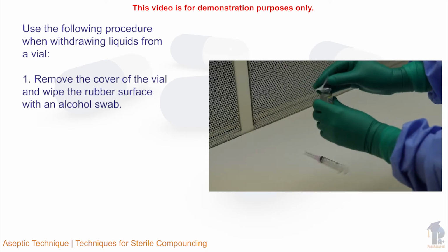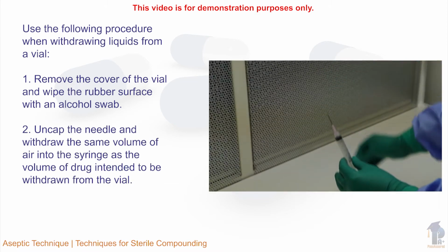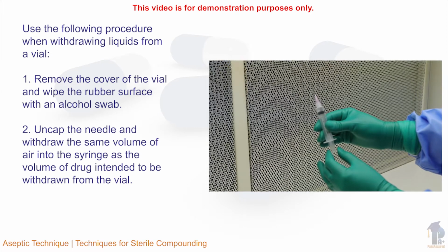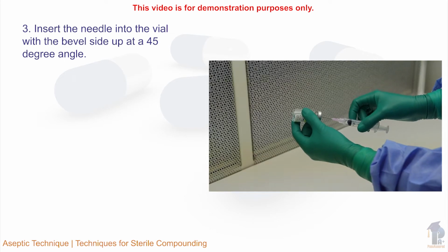Remove the cover of the vial and wipe the rubber surface with an alcohol swab. Uncap the needle. Withdraw the same volume of air into the syringe as the volume of drug intended to be withdrawn from the vial, and insert into the vial with the bevel side up at a 45-degree angle.